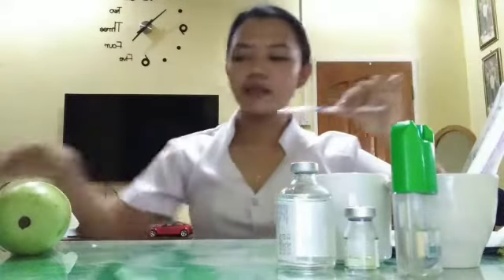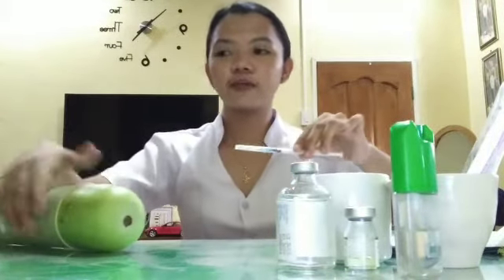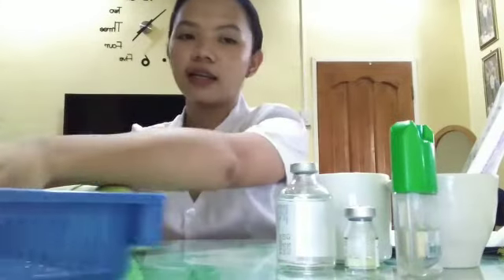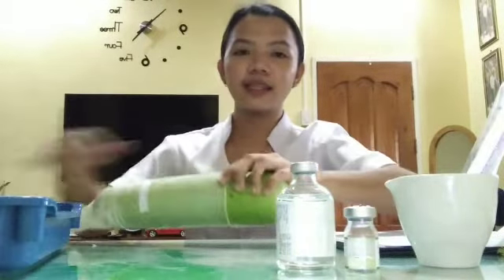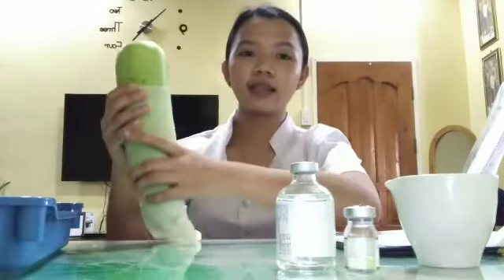So here it is. Next thing to do is we will put it on the tray, and then we will use alcohol and the dry cotton balls. Next, we will locate the site.